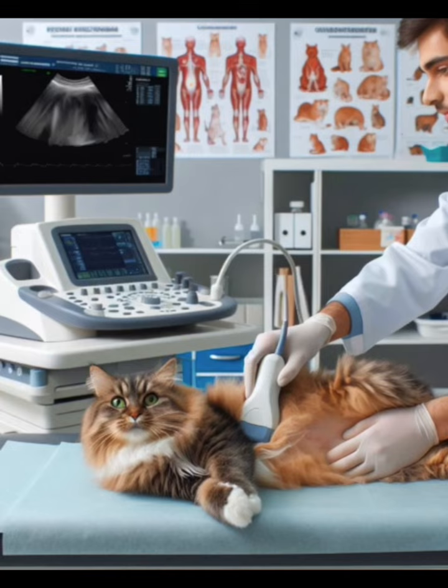A tissue-like pattern, also known as alveolar syndrome, signifies a complete loss of aeration in the affected area due to consolidation or atelectasis. Finally, pleural effusion is the collection of fluid in the pleural space, which can have various appearances on ultrasound.